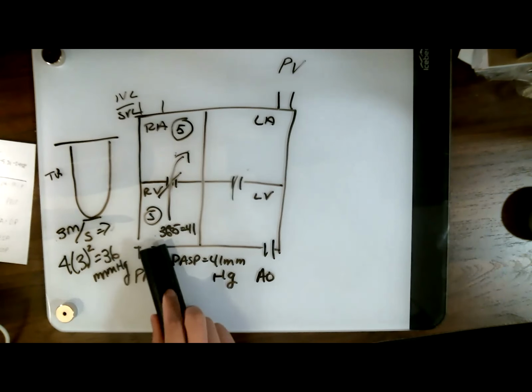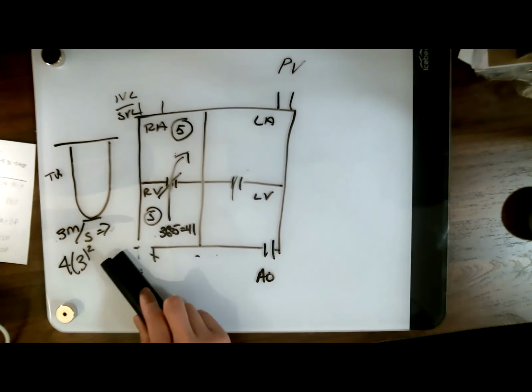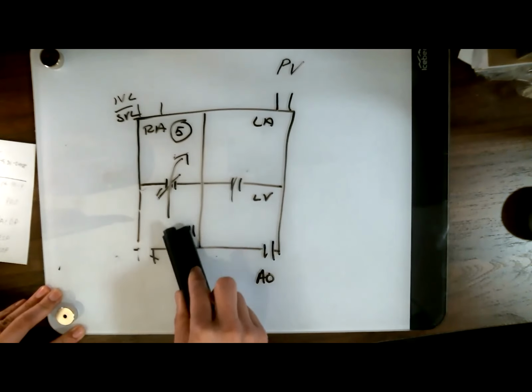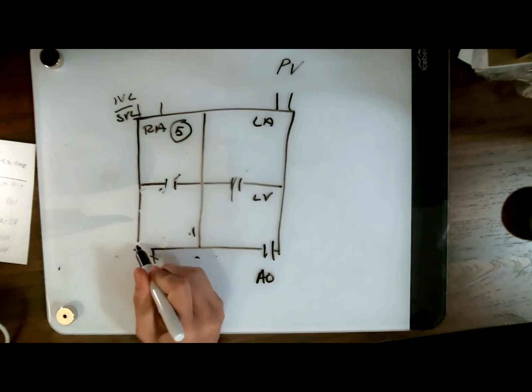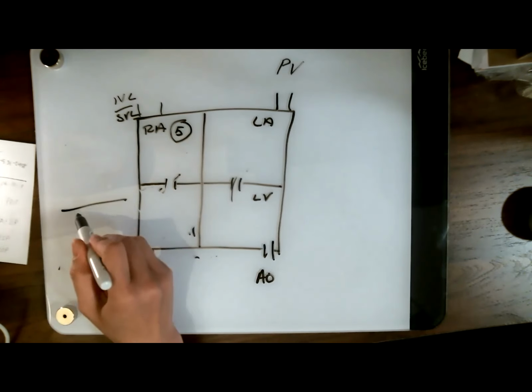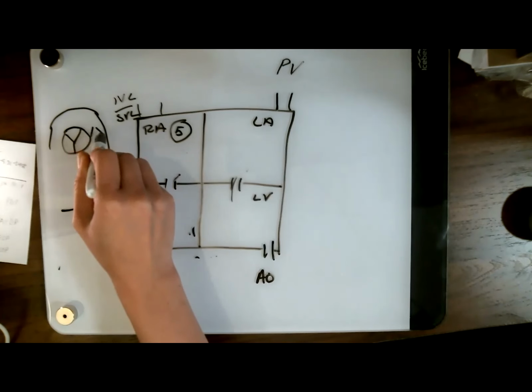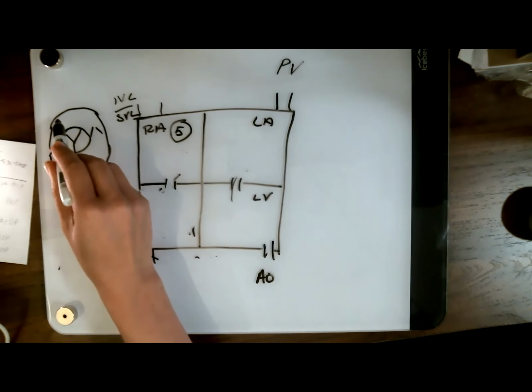Let's use the same example to move a little bit further and pose a situation where you have that RVSP, but that RVSP is not necessarily your PASP. That situation is when you have pulmonic stenosis. So at this point in systole, let's say you're at the parasternal short axis view at the level of the aortic valve, and here's your pulmonary artery, here's your tricuspid, and here's your RA and RV.